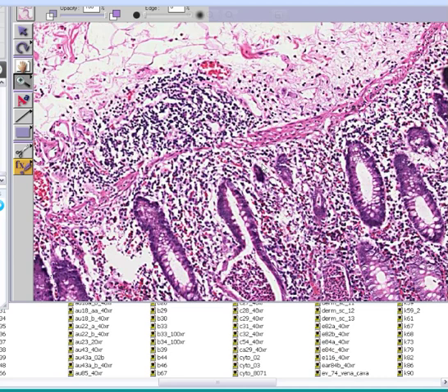Okay, got it. Is there anybody who can't see the blow-up view of the colon yet, where you could see a lot of glands? So what you're seeing here towards the bottom is a mucosa. What you're seeing between the glands of the mucosa is the lamina propria. And I think I could convince you that there are a lot of extra inflammatory cells in this lamina propria.